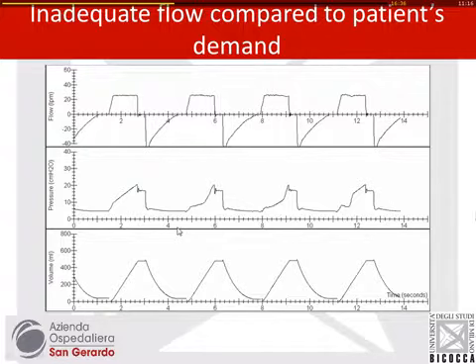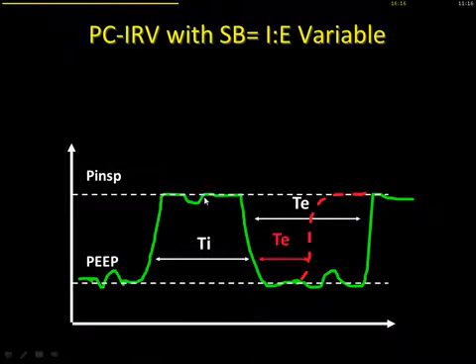Many of these examples I will show you today are something you become familiar with by looking at ventilator waveforms. So my suggestion, maybe an obvious one, but still, is to always try to look at the waveforms, and you might recognize similar patterns.